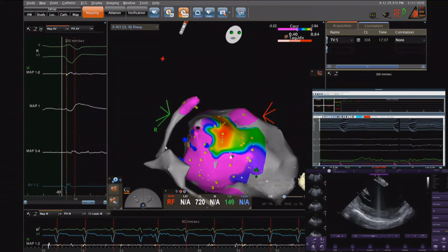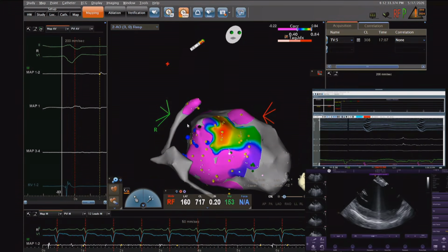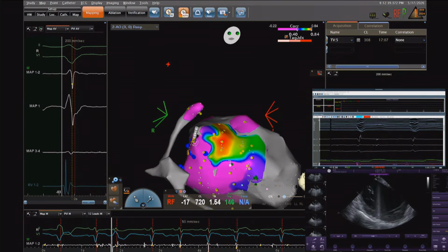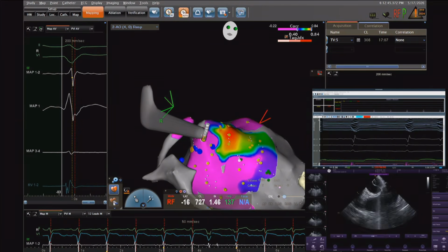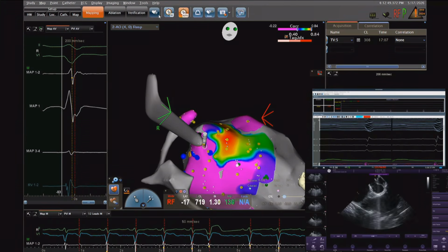Okay. And were there any signals of the conduction system proximal here at this region or not? Yes. You see, these blue dots anterior, that you see the fascicle here. The blue dots correspond to the HIS. Okay, can we map? I can take a point, not FAM, just point by point, okay?